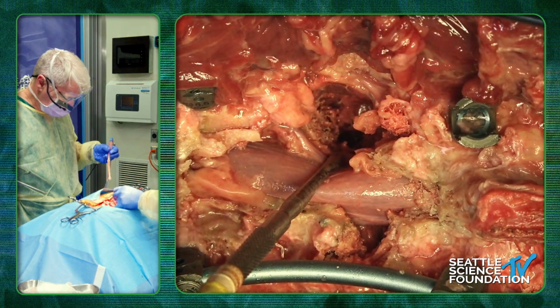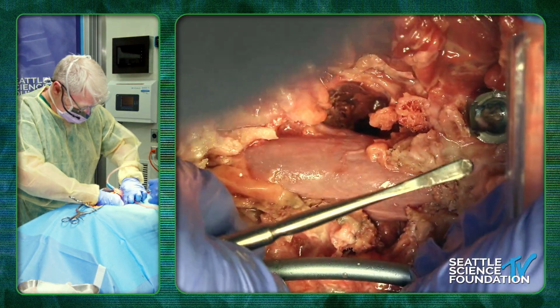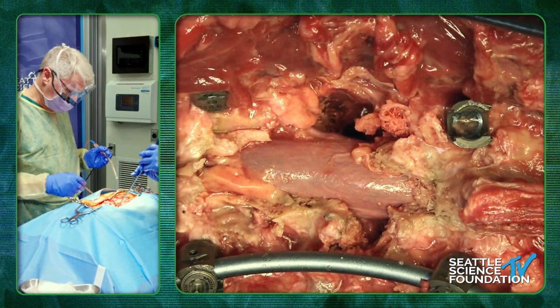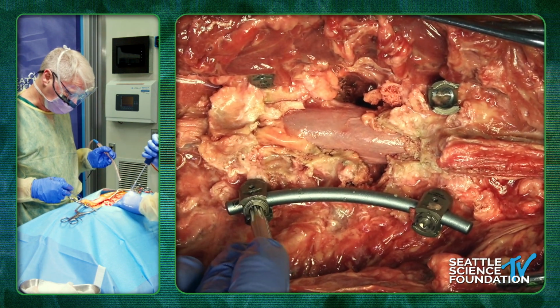Okay. And then we'll tighten our screw now. Let's tighten those screws, so we don't want it to collapse on us. So we're going to either distract or even just tighten those down now.